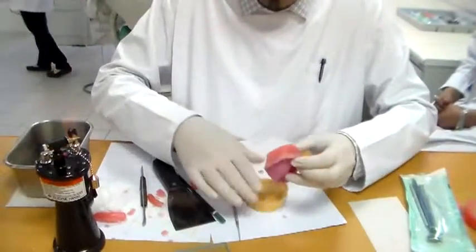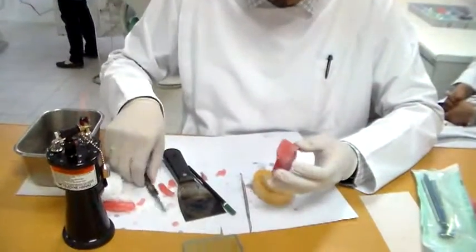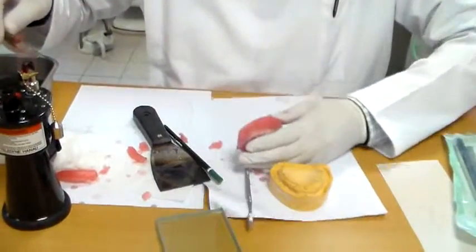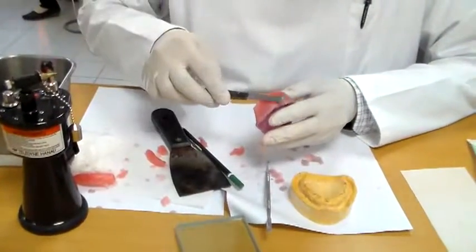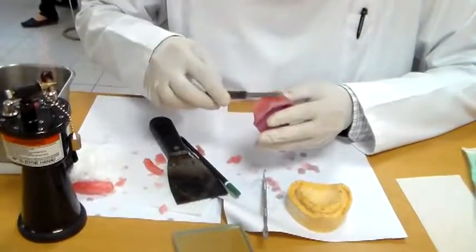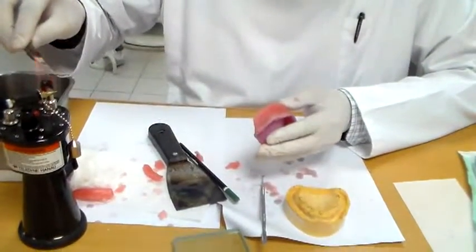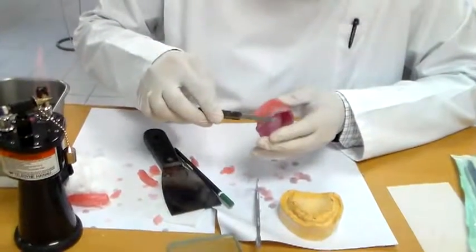Then I want to give it some shape from the outside, which actually gives it the definition. It's very easy to do. Just run your instrument along the record base and the occlusal rim, touching the record base at the topmost portions.